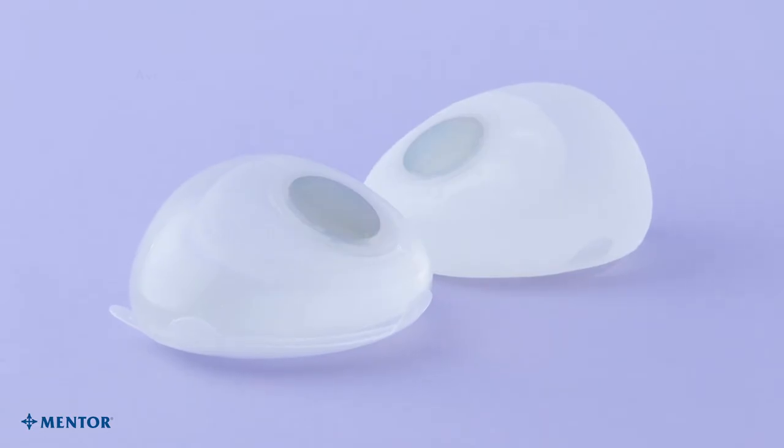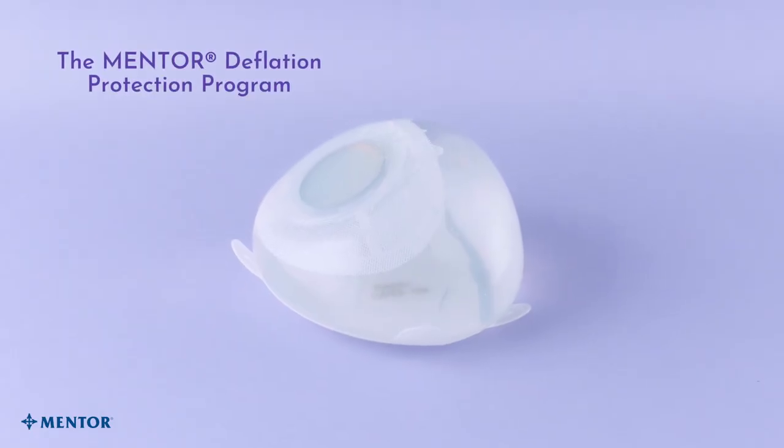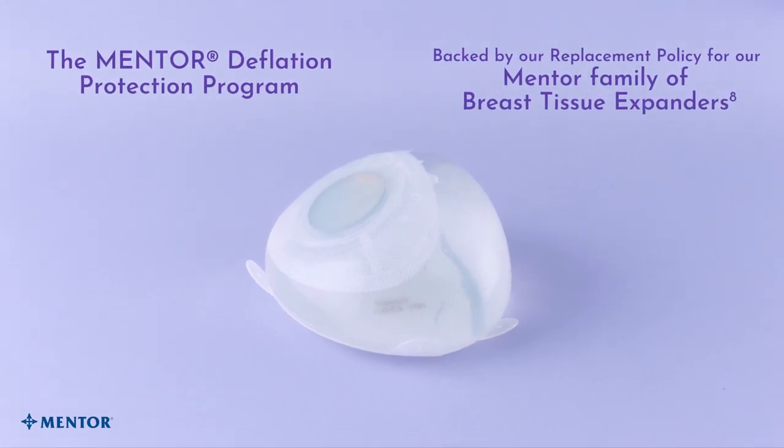CPX4 Expanders are available in smooth and Siltex shell surfaces. The Mentor Deflation Protection Program is backed by our replacement policy for our Mentor family of breast tissue expanders.